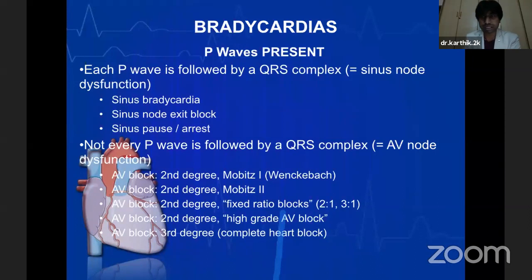Alternately, you should also be clever enough to check the medications of the patient, because in today's world, many of the elderly people have already had an episode of myocardial infarction and received treatment, and they may be on beta blockers. And sometimes elderly people who have atrial fibrillation may be on rate controlling agents. So you should also simultaneously check the medications of these patients to see whether it is a drug-induced bradycardia or not. Now, once you've determined the PQRS relationship, the next step that you have to assess is whether every P wave is followed by a QRS complex.